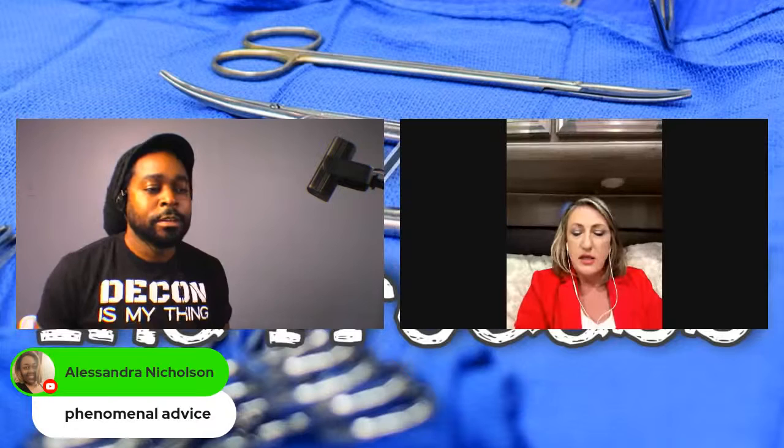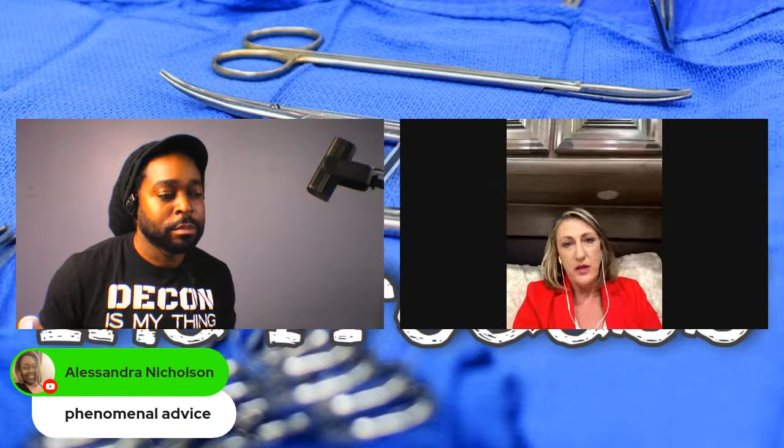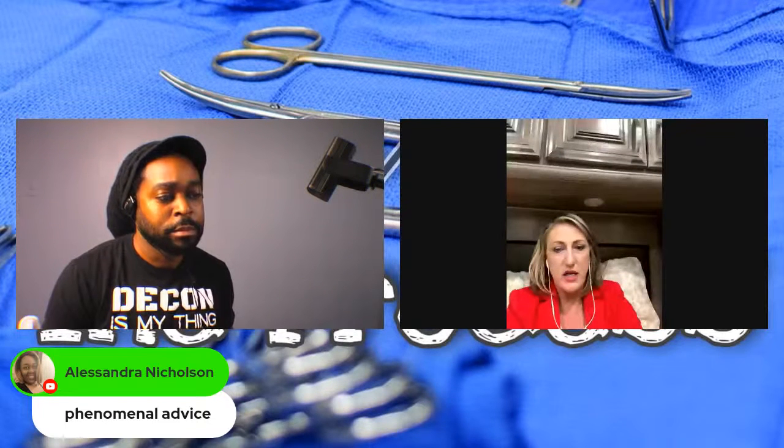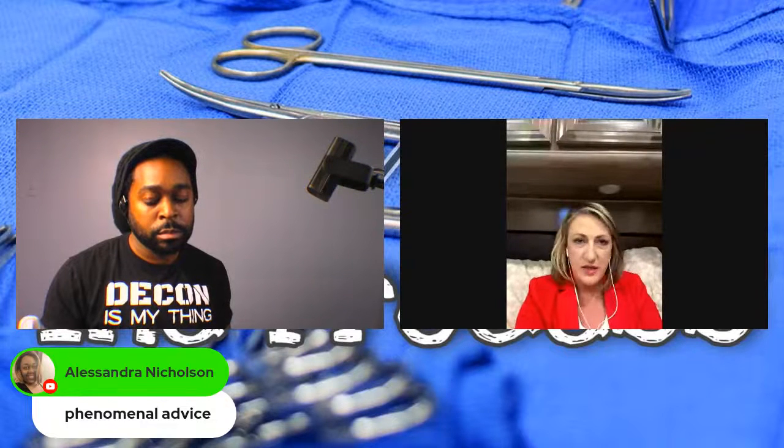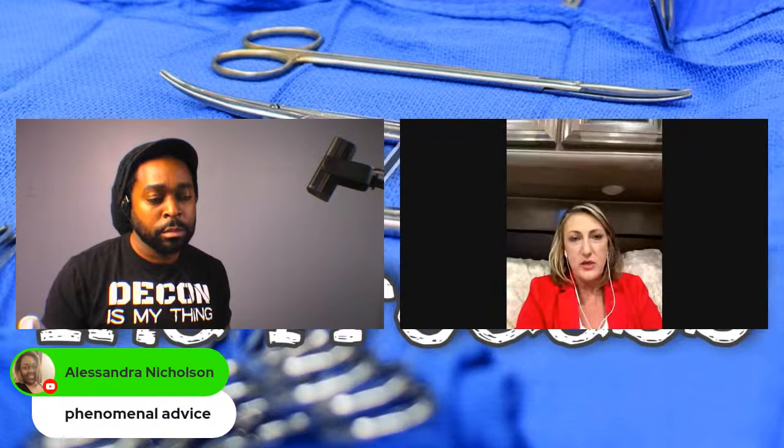But the last thing I just want to make you aware of is also the fire hazard that we see in a lot of hospitals. I've seen a lot of hospitals across the country this past year and last year written up for this, and that's keeping supplies, or storing anything, behind your autoclaves or your washers. Those are hot zones, and that's the repair area for them. We see facilities leave ladders and parts in there. Do not store things in those areas because they have to be clean and free. It's also a fire hazard if they're storing things behind there.